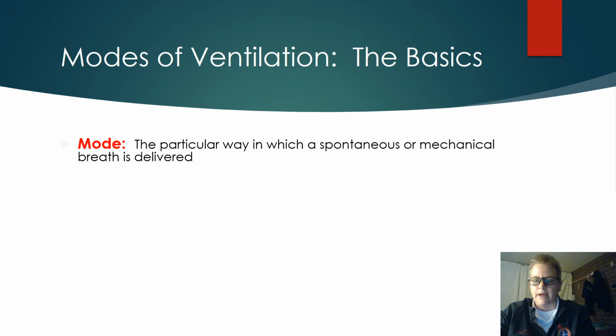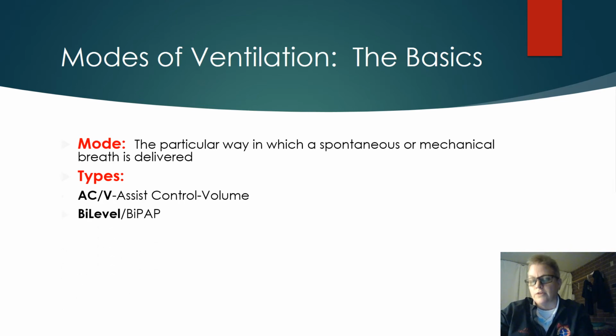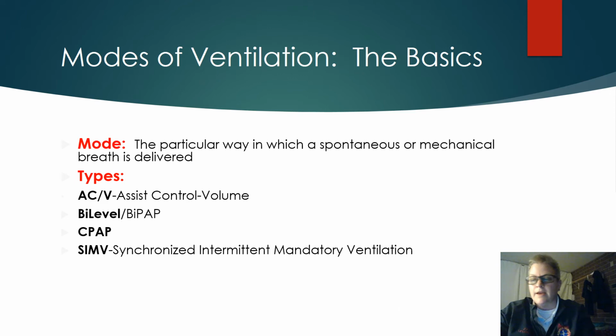But we are going to talk about assist control volume, bilevel and BiPAP, CPAP, and SIMV or synchronized intermittent mandatory ventilation. These all can be used in volume control, which is what we as the common paramedic can do, or pressure support as well. I'm not going to talk about the pressure support part.